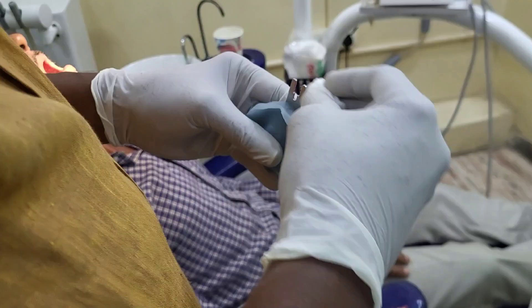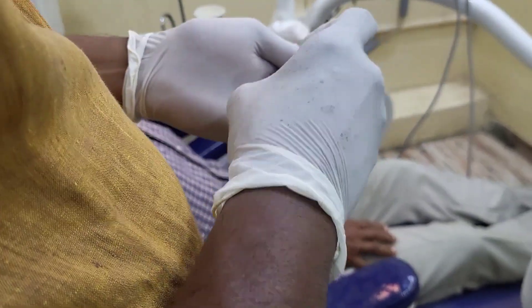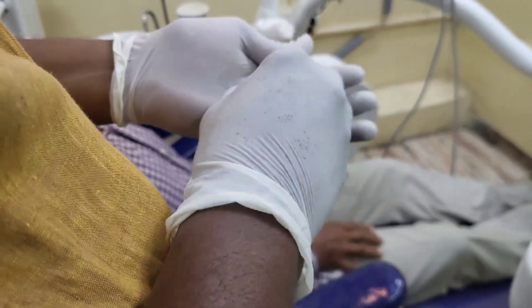After checking, we are ready to proceed with the border molding procedure. We are wiping out the saliva with the help of cotton.